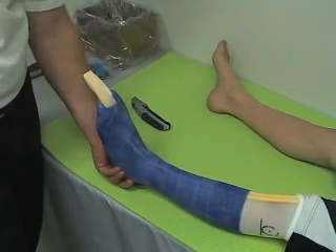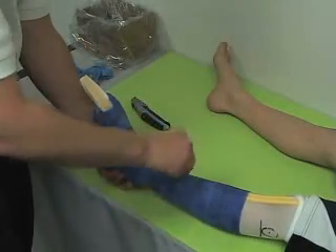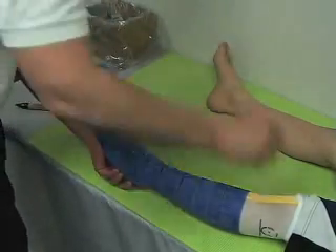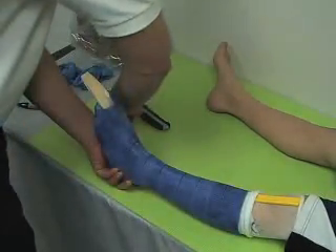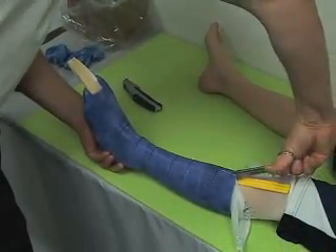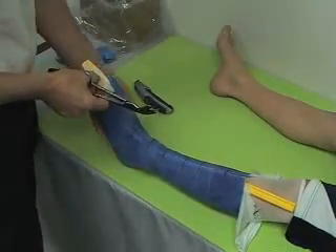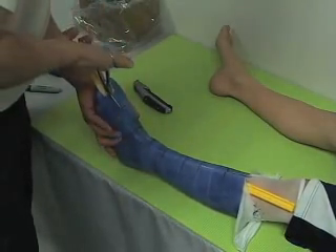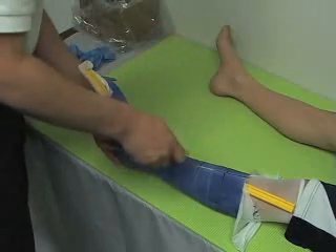Now that our cast is set, it's time to remove the cast. Importantly, draw hash marks across where you will be opening the cast so the cast can be applied and resealed in the appropriate alignment. The technique we are going to be using here involves a hook knife down a special channel with a slot. We start with the scissors and cut clean down, then apply the hook knife.